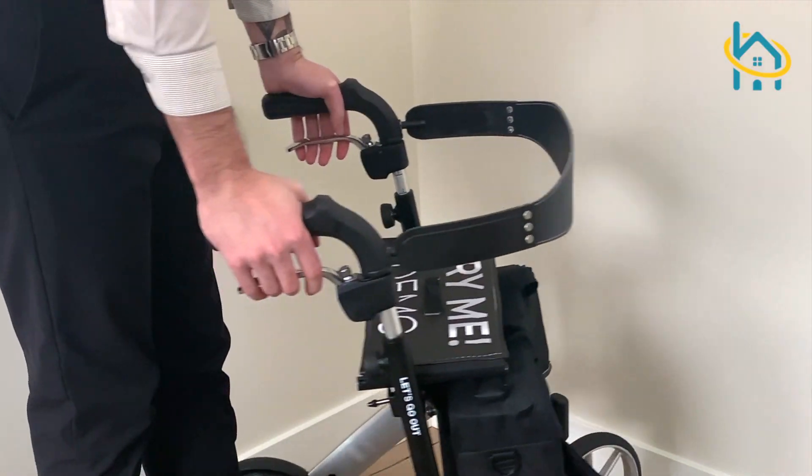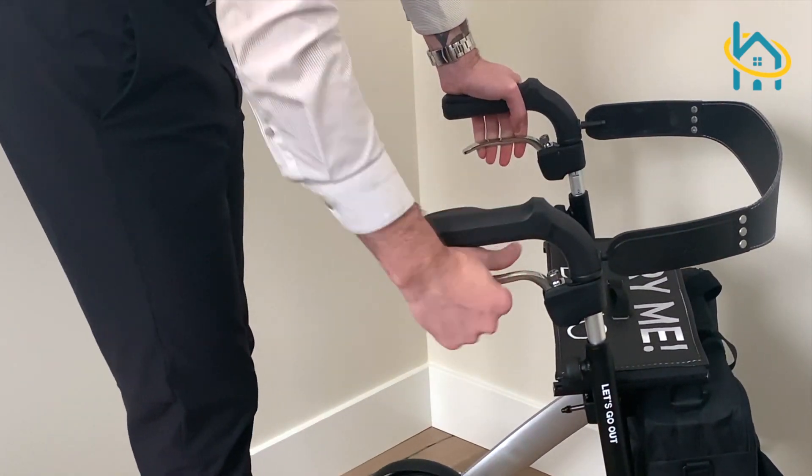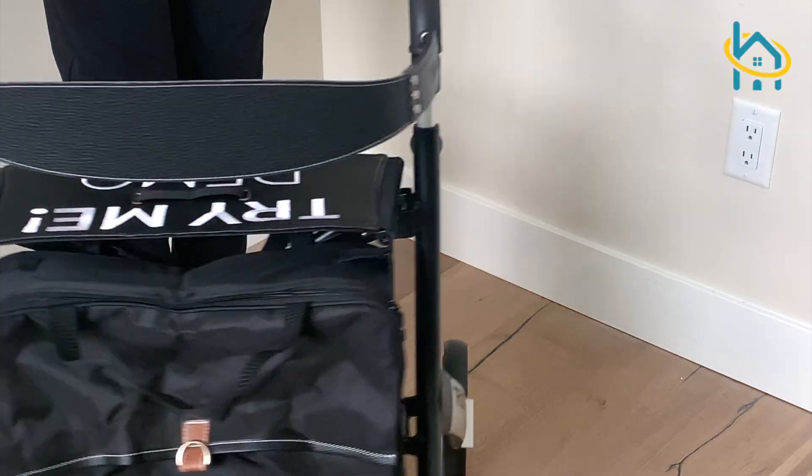It also has brakes that can be locked into place by pressing them straight down. To release the brakes, just pull them back up.